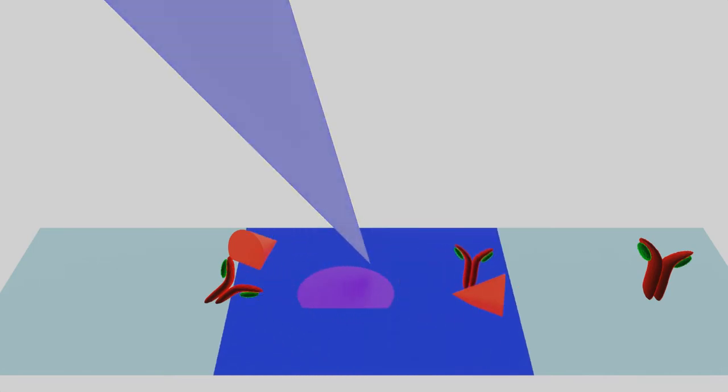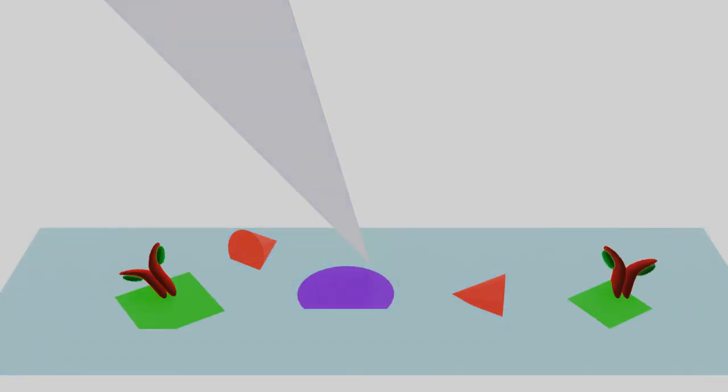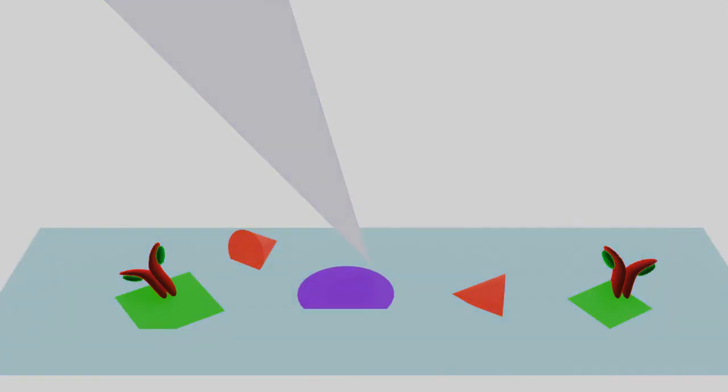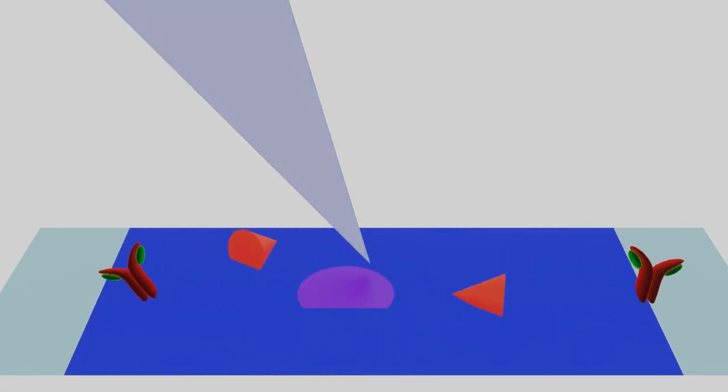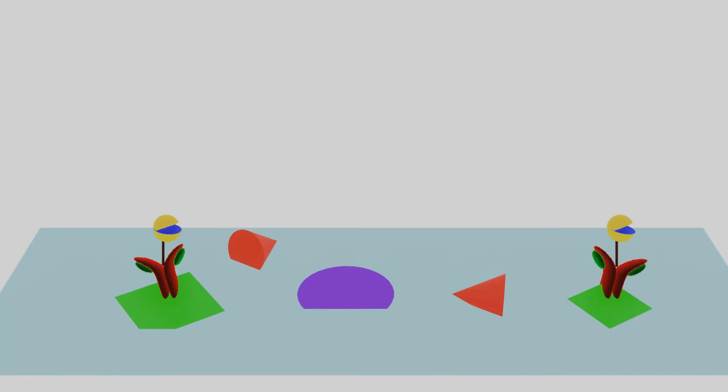The extra fluid is washed off. If HIV is present, the antibody remains after washing. But if HIV is not present, the antibody no longer remains in the well. Oh, forgot to mention, the antibody that was added had an enzyme screwed to it.